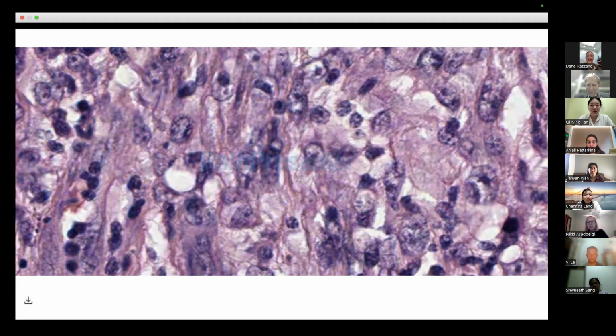But you can see it positive in angiosarcoma, which is something I actually liked because for angiosarcoma, you don't have any marker. So I do PRAME, and when it's positive, I'm between borderline of some intermediate ones. I'm like, oh, it's PRAME positive, so I'm leaning more toward, for example, angiosarcoma. But the main use of it is in the melanocytic lesion.